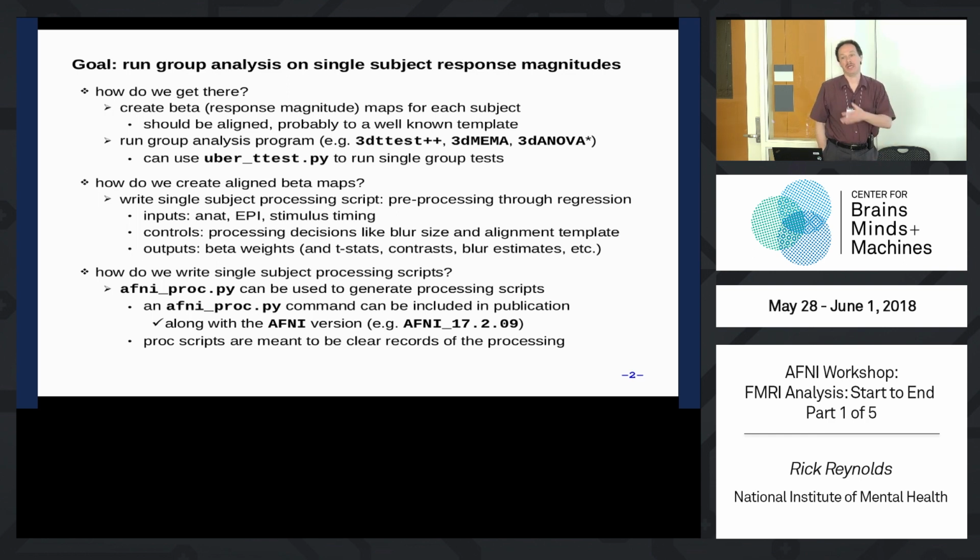What is better, Talairach space or MNI space? That doesn't make a whiff of difference there. You just pick something that is a space that you actually want to talk about. So once you get your data in that space, then you can just run your group analysis program. Gang will have lots to say about that.